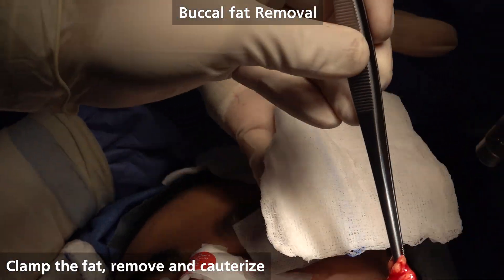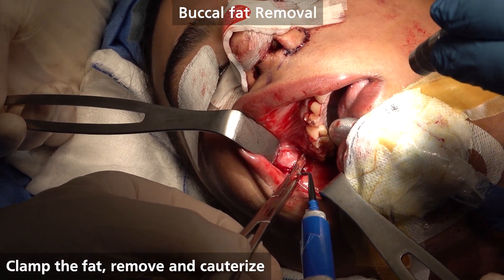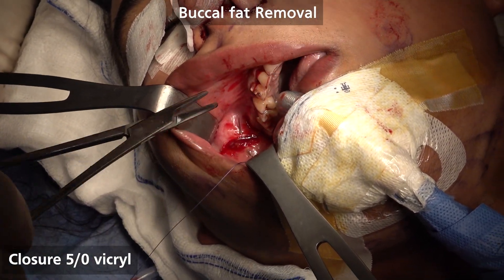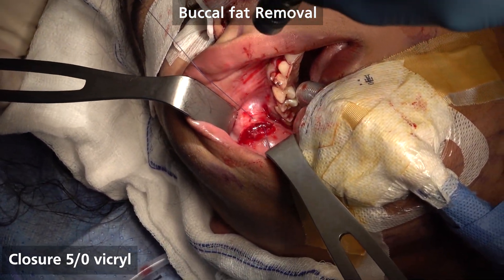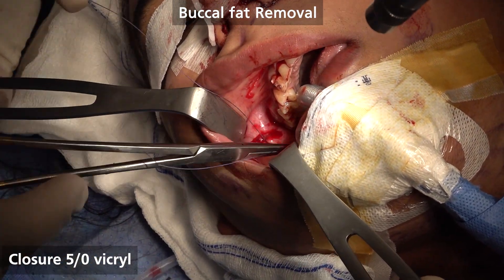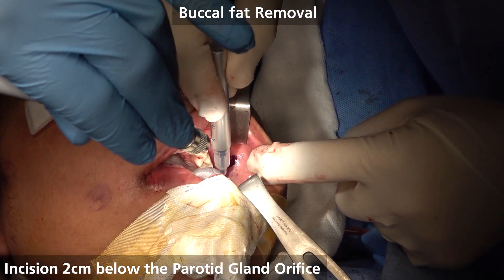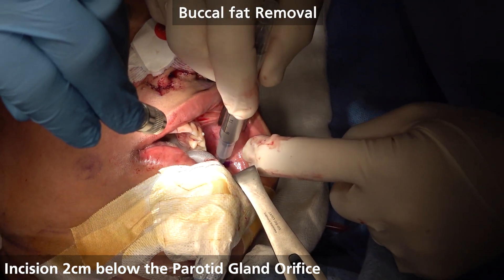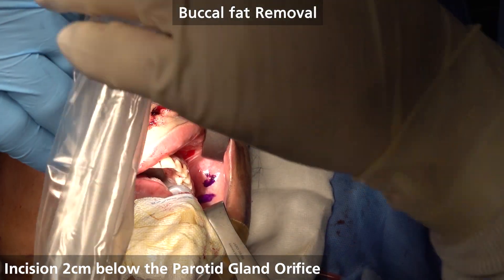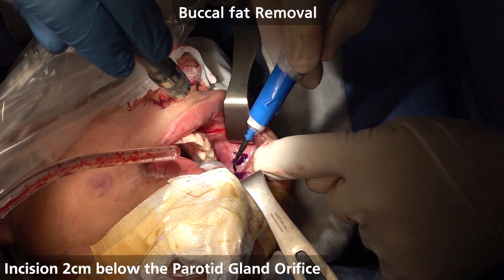So when this fat is removed, you see it's from the buccal fat. Now identify the parotid duct orifice there, and then we go two centimeters below and to the back. We're finding the fat now.